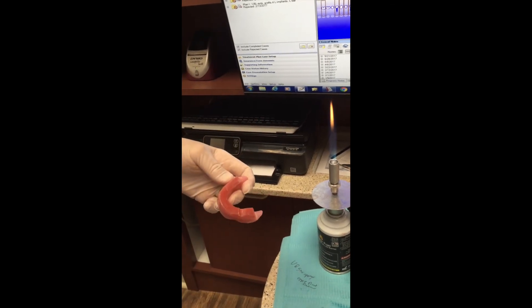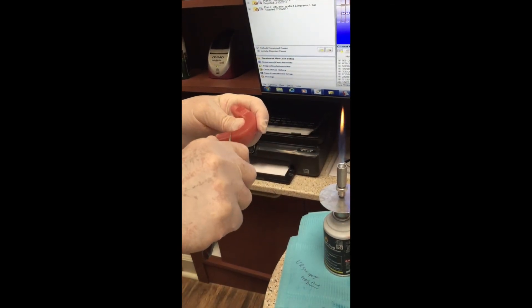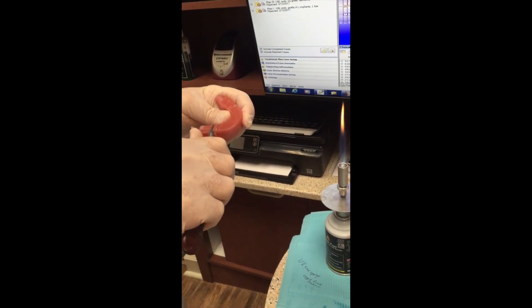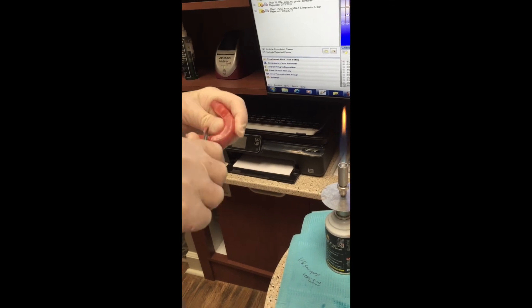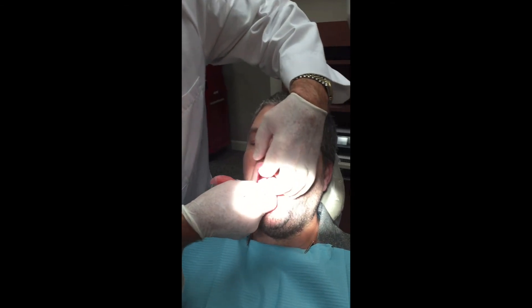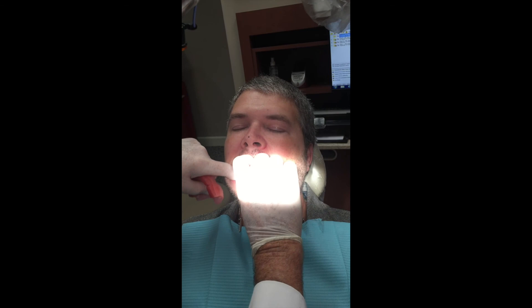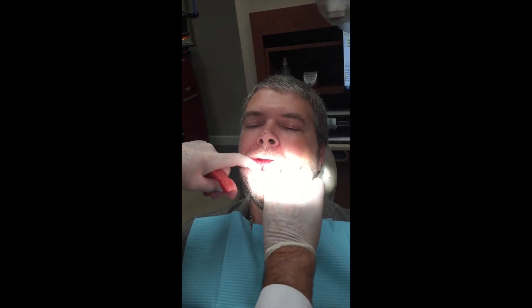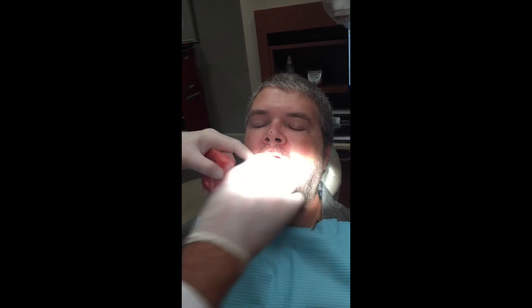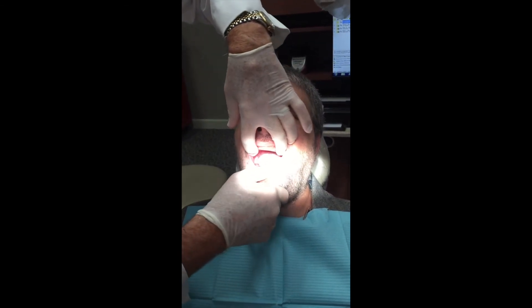In dental school you had to do this yourself when you were training to be a dentist, and there was a reason — so that you'll know when you have your lab do this whether they're making them correctly. If they don't make them correctly, then you've got to come back and make them correctly. Let's see if we can get this to fit together.